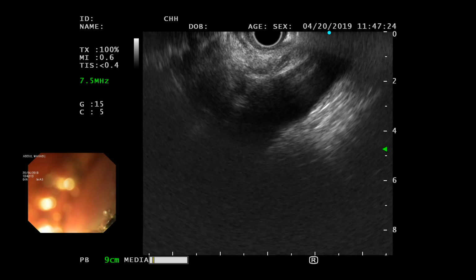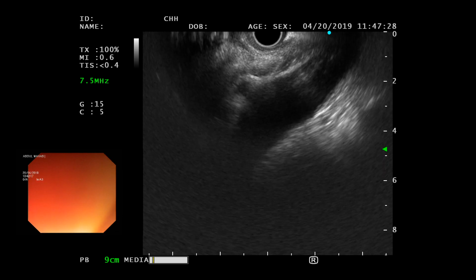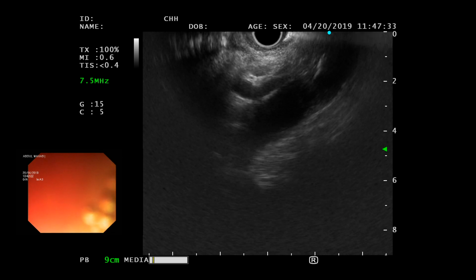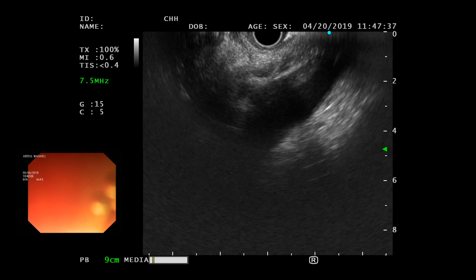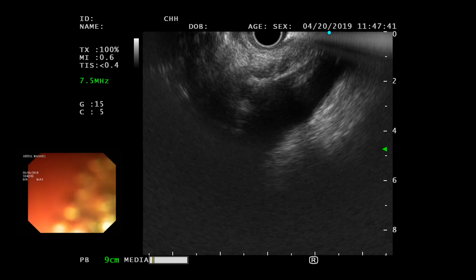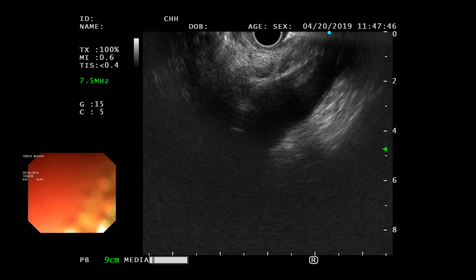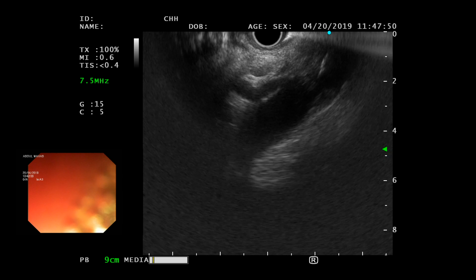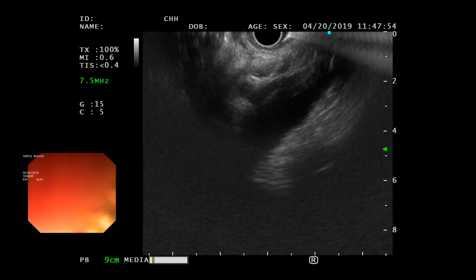But many times you're not going to see a ganglion completely, even if you see it. When I was looking at the literature, I think just injecting straight, simple, one side rather than two sides. Ganglion, if you see, fine. If you don't, even then, the problem is you go into that ganglion, you're going to inject, everything's going to go white. So after that, you wouldn't know really.